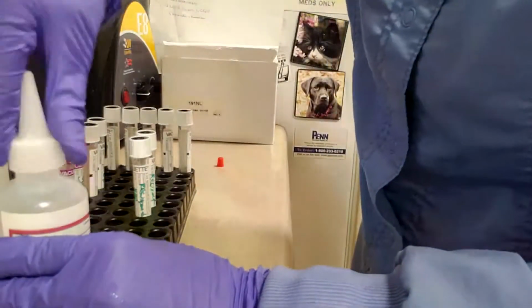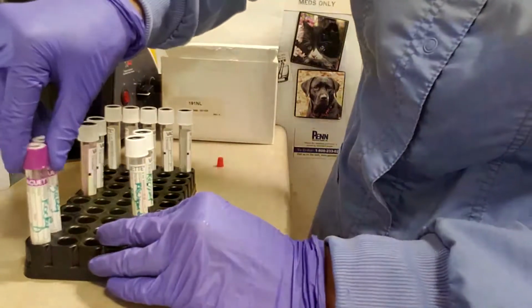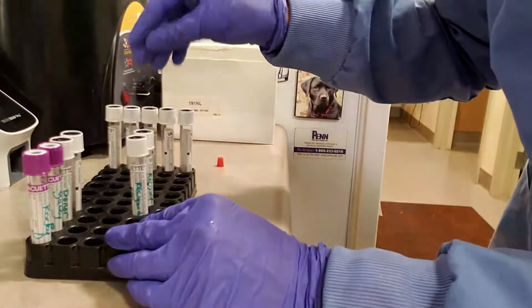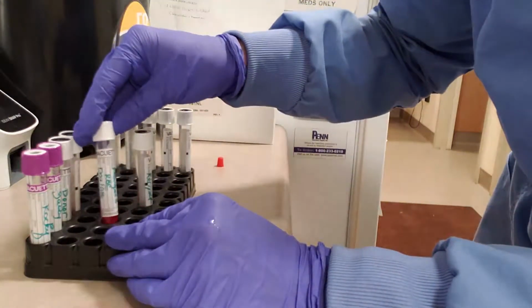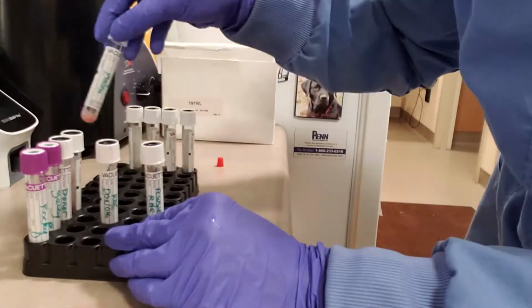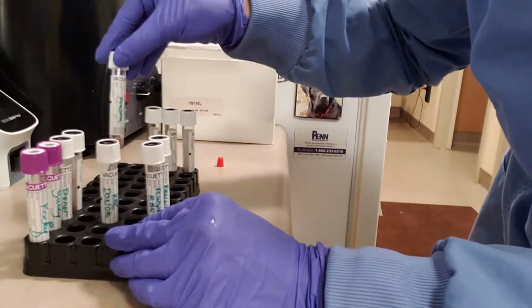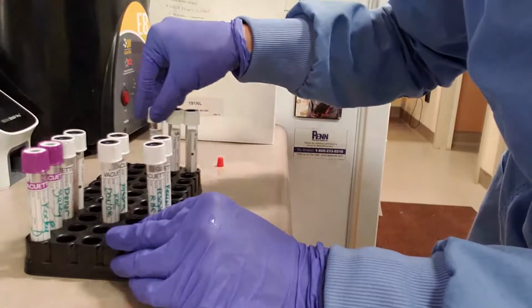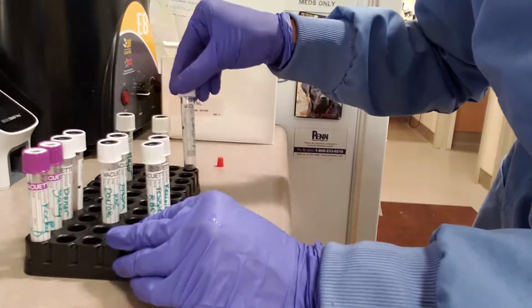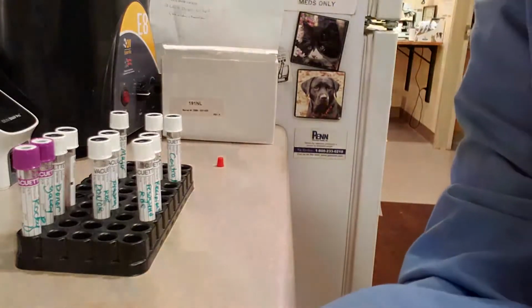So now we will clean up our area before we get to the next part, because we have a lot of tubes here. We want to make sure that we're using our correct tubes. So let's do our donor on one side, our recipient on the other. So this is our recipient plasma, so we need that. And this is our donor plasma. And then we have our major cross-match, our minor cross-match, and our control.